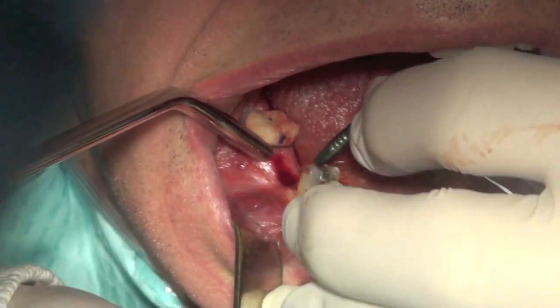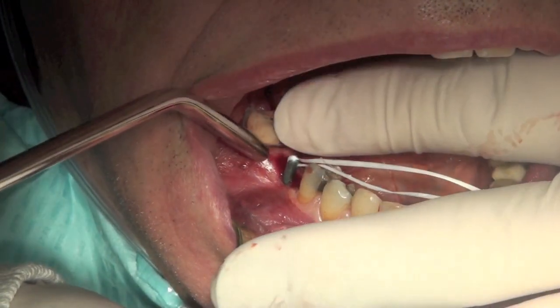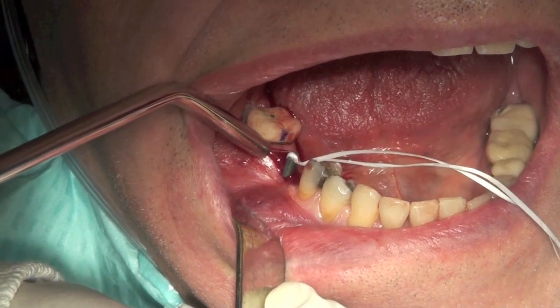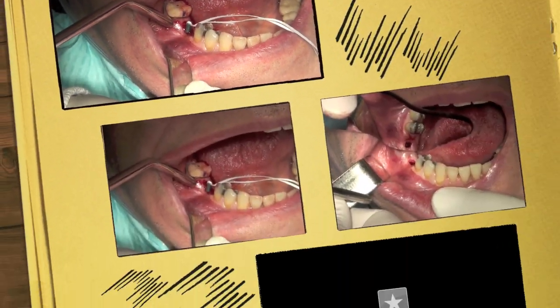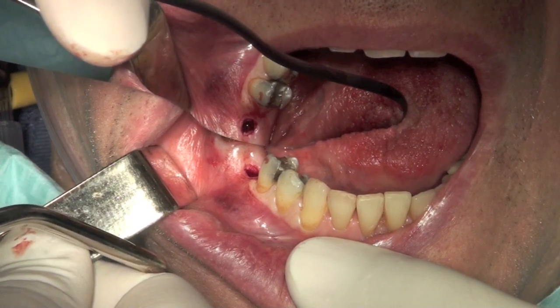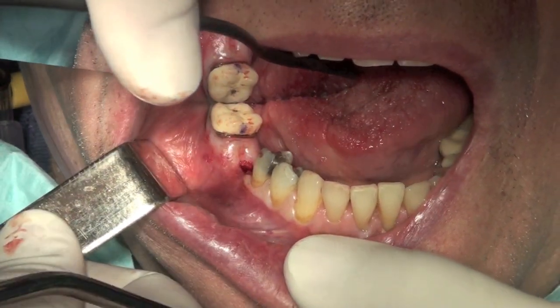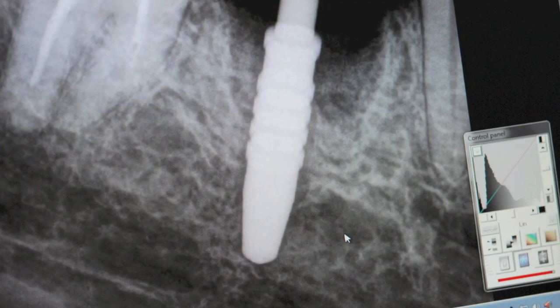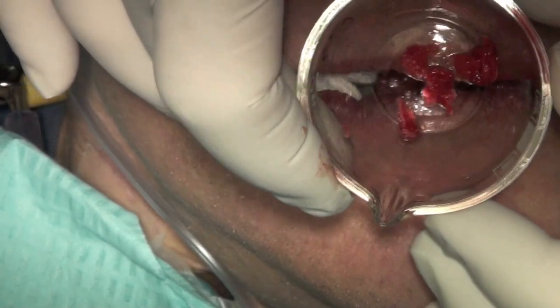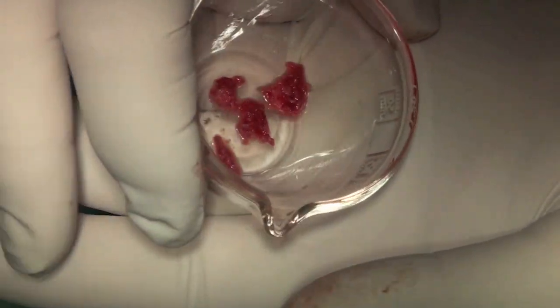Let's take this x-ray now. How much is in there? F3 in here. Let me see the F3.